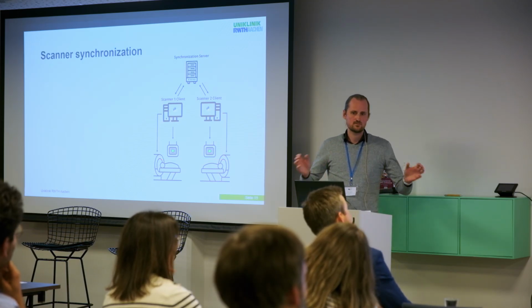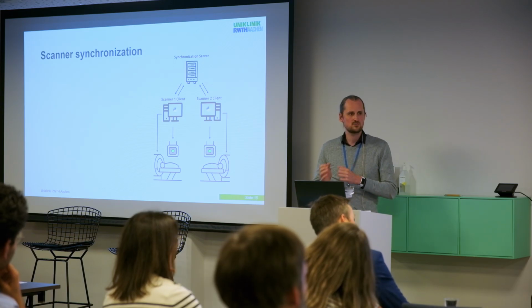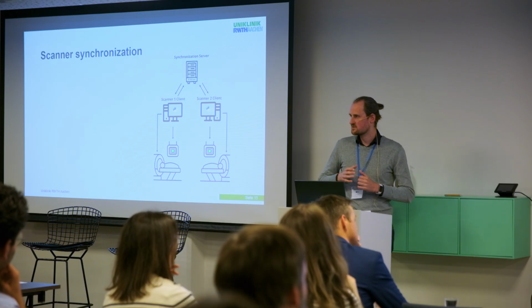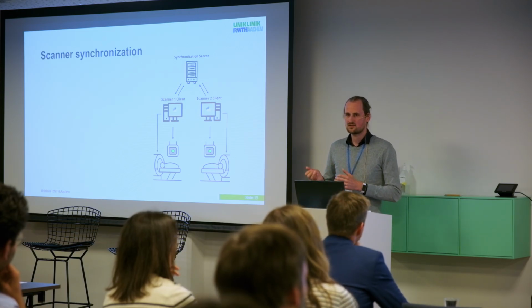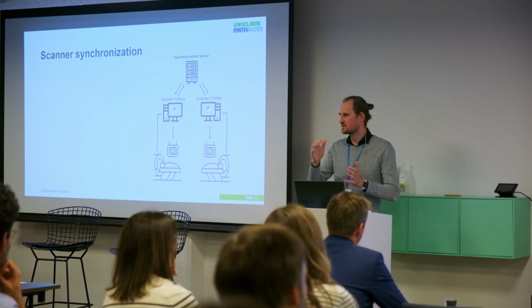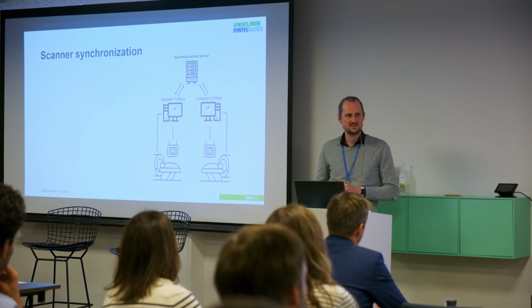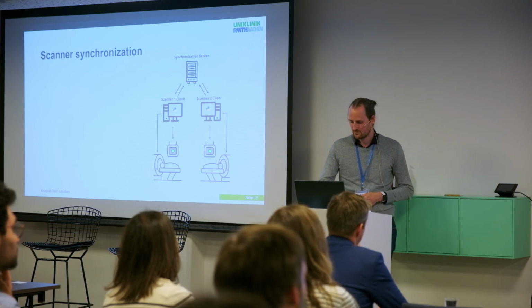When we have two stimulus PCs which are synchronized, it's quite easy actually to synchronize the MRI scanners after this. When it comes to MRI scanner synchronization, I happen to know it is possible to trigger the image acquisition at Siemens MRI scanners using a direct trigger. However, this is not that easy to set up, and we prefer something simpler.